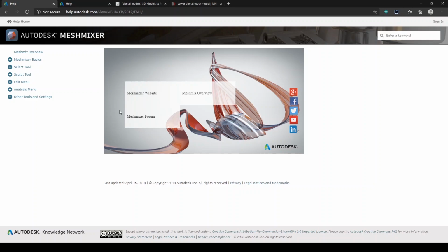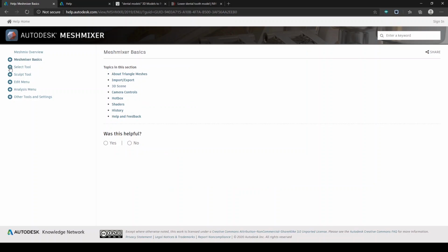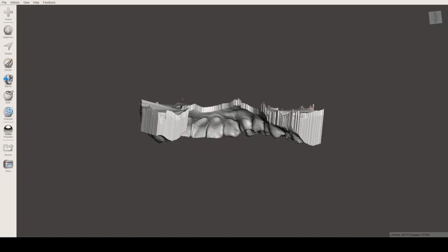What we're going to learn in this course, as I said earlier, is just the basic functionalities that will help you survive as a dentist or as a user or consumer of Meshmixer. If you want to learn more or be certified, I believe Autodesk offers certifications or exams as well. I don't know how much it costs, but you can research about it. I'm pretty sure other institutions out there offer Autodesk Meshmixer certifications. You can also learn it by yourself. There's a manual here and it's pretty straightforward. This software is not really complicated. So let's go through it with our model now.